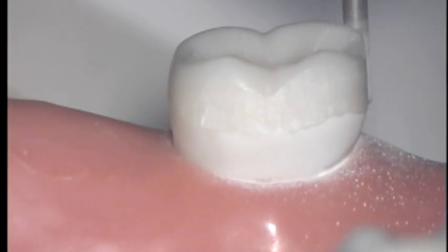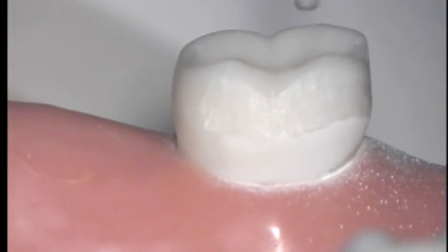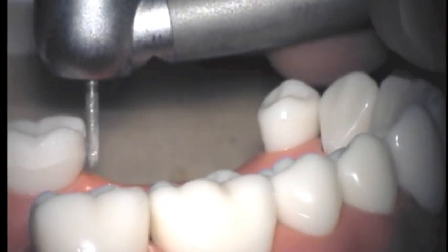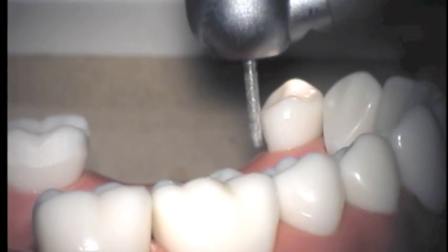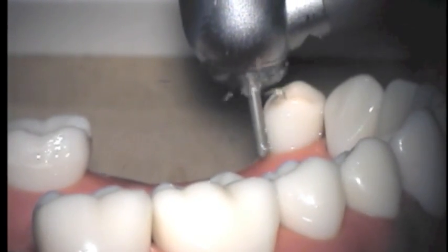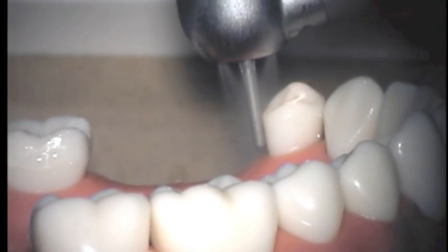Otherwise, once you go back, you won't have anything to reorient your burr, because now your tooth surface is altered from what you see on your cast. In order to put your burr back against the tooth in the same plane, you'll need a wide enough guide plane to actually place your burr flat against the tooth. If you've got another tooth close by that will also have a guide plane prepared, you can use the guide planes you've just prepared to move the burr back and forth between the two teeth to ensure they're parallel.